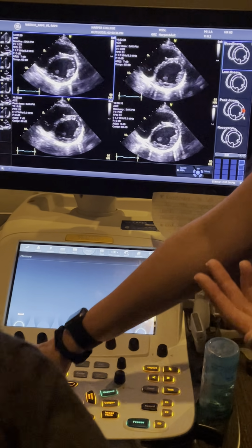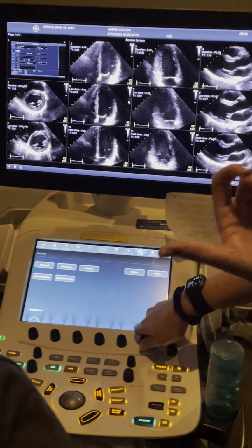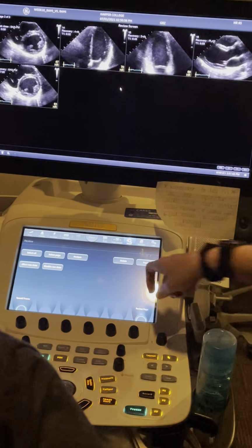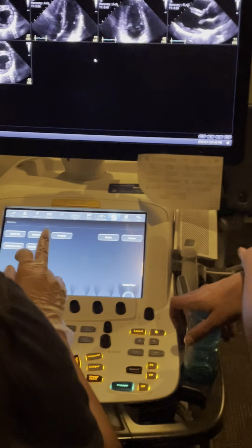And then again, we'll go to review here, and we won't have a continuous capture because we didn't do one. But if we did, we would delete that. But this is, and we'll just end it. Oh, just end. Yep.